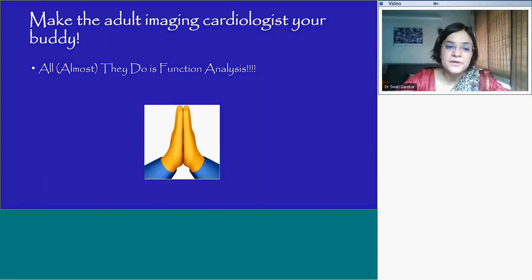Adult imaging colleagues do diastolic function all the time. Most of the time they're analyzing the diastolic function of their patients. So let them help. Make the cardiologist your buddy. Read good studies with them.